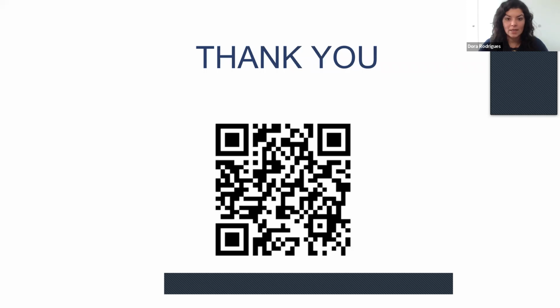So every single case that I use photogrammetry on, there are no tie bases. The only tie base would be for the final ceramic if we go that route. But you don't have to. Photogrammetry is so accurate that you can even go straight to the multi-unit with ceramic. I didn't try it yet. I know there are a lot of doctors using it. I just need to get comfortable before I present that to my doctors. But it can be done, because of the accuracy of the photogrammetry device that you use. So for all my prototypes, there are no tie bases.